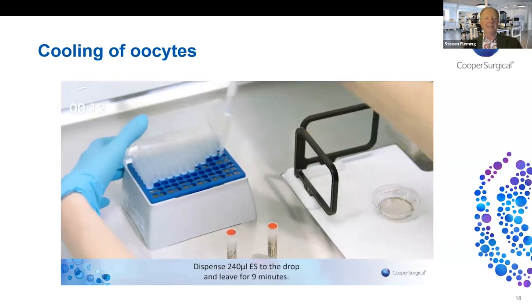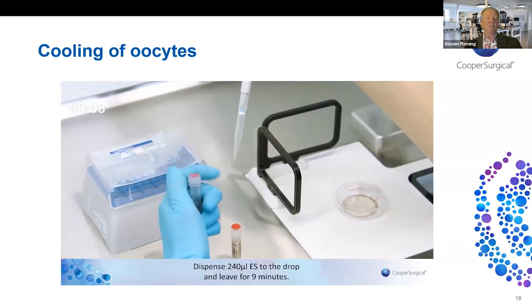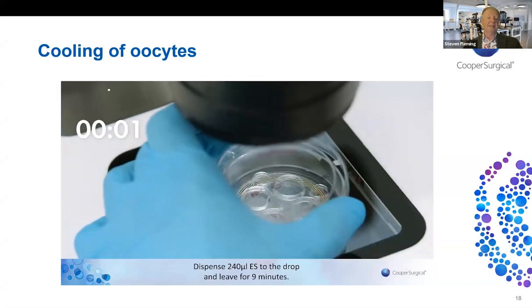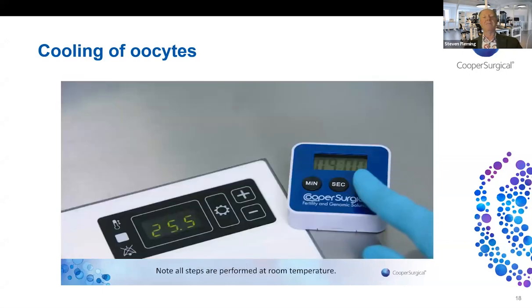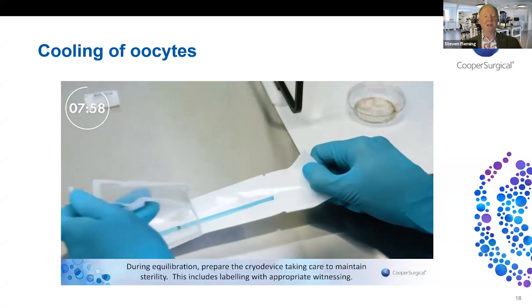And then finally, getting up to the full concentration of equilibration solution required by adding 240 microliters to that same drop. And then leaving them to equilibrate for a further 9 minutes. So that's a 15-minute equilibration in total.